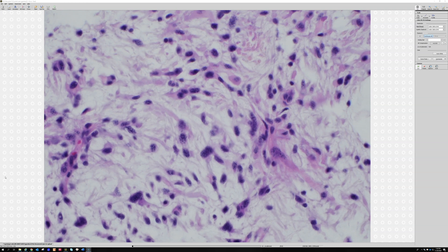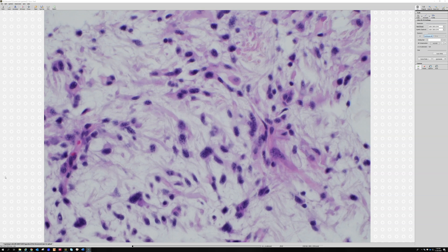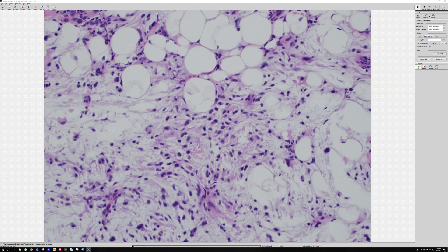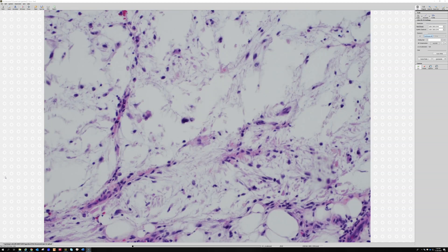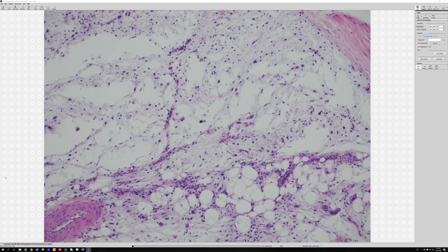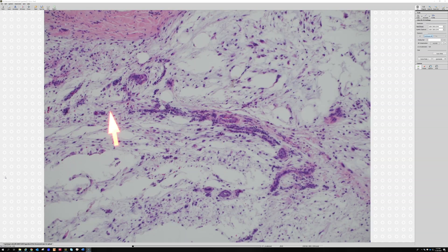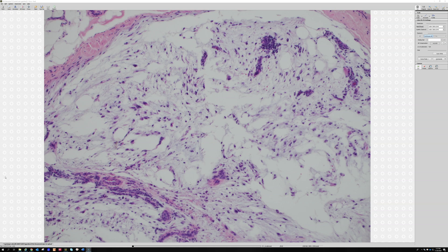There is atypia here. By definition, to make a diagnosis of myxofibrosarcoma, you have to have at least some atypia — some hyperchromatic atypical cells or pleomorphic cells scattered in the myxoid background, usually with these kind of prominent elongated vessels. You get these long vessels that people call curvilinear, these long vessels that snake through the myxoid background.